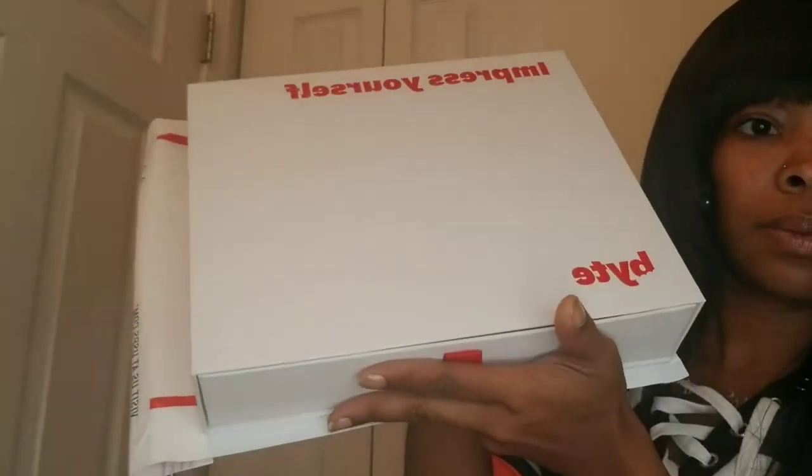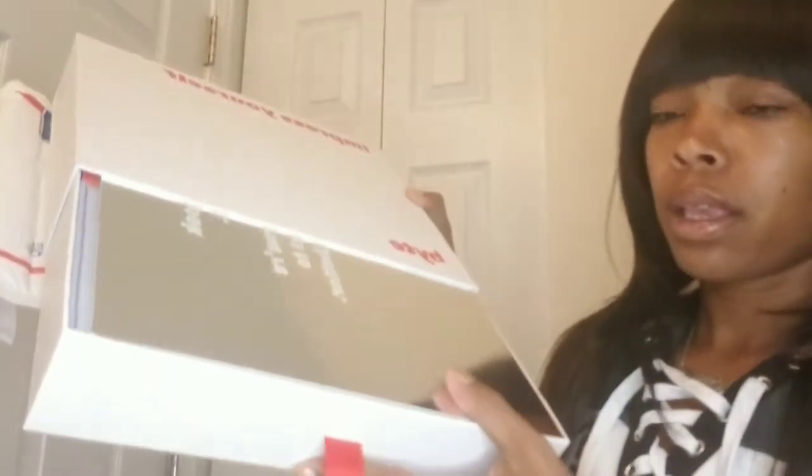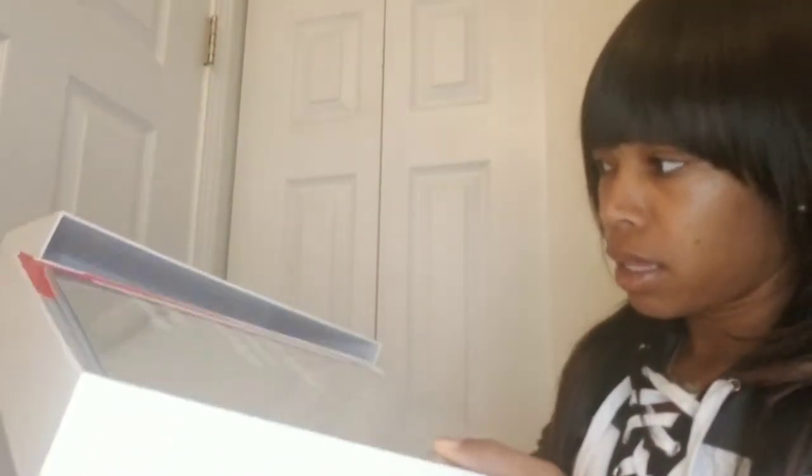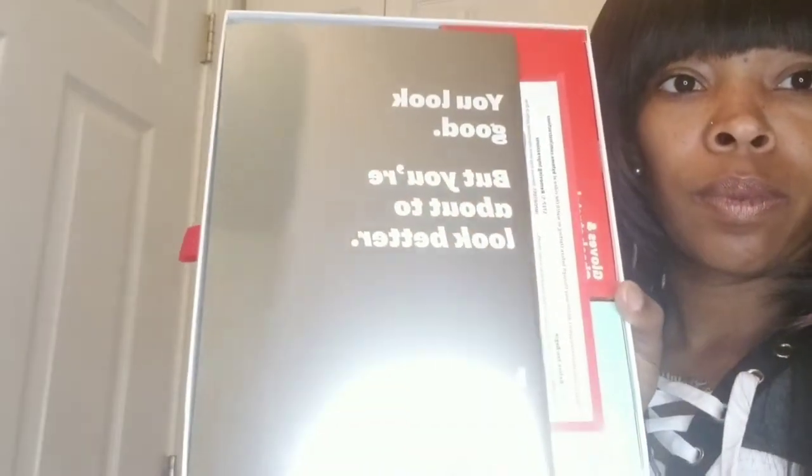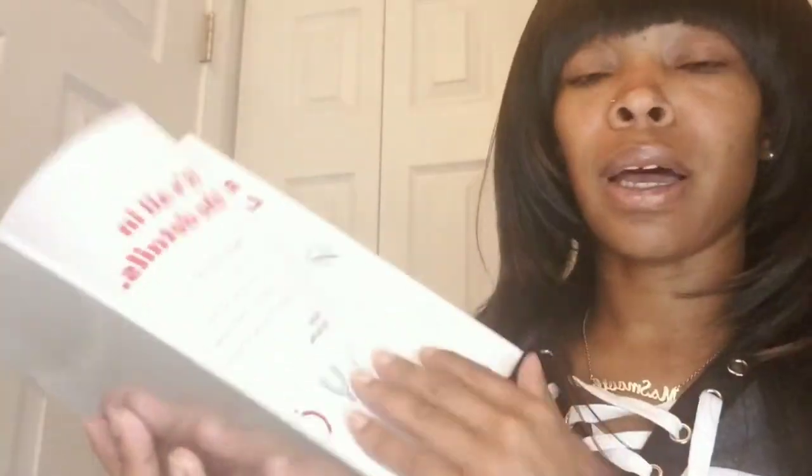It says 'Impress yourself, Byte,' and this is what the box looks like. I'm going to open the box and show you guys what's in it. It says 'You look good but you're about to look better, Byte.' This part of the kit — it's just your manual and it tells you about how to do everything.